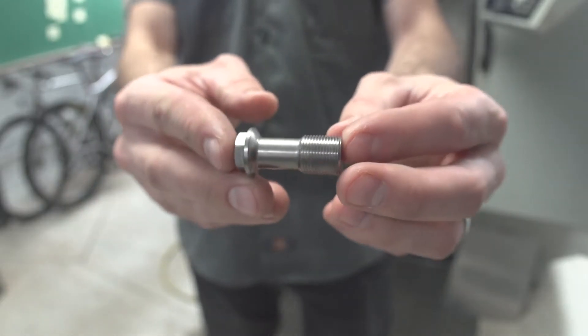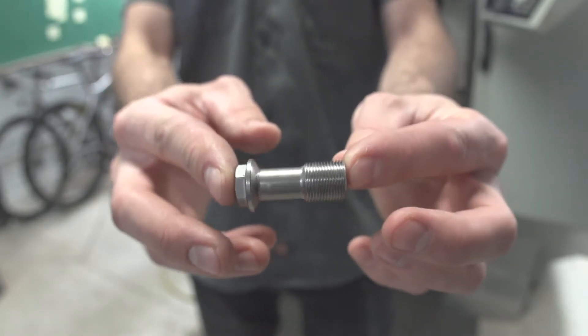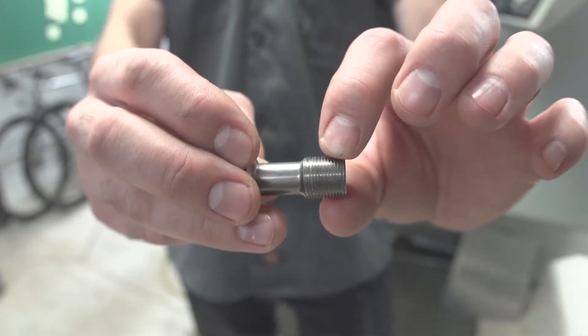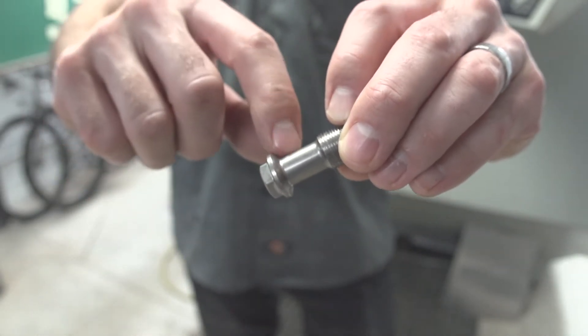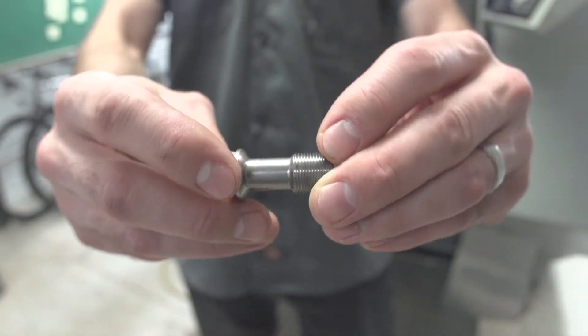This is a very special bolt for a prosthetics application. First of all, it's titanium. We've got an M14 by 1.0 thread right here, which is a bit odd. We've got an undercut shank, and we've got a tapered head. The bottom of the head is tapered, so this needs to fit into some type of tapered socket.